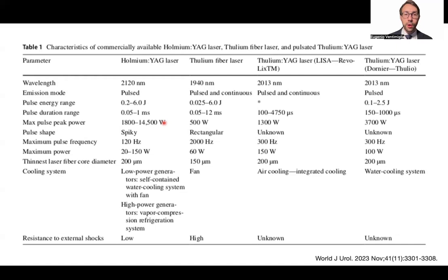And you know, if you like HoLEP very much, and if you follow this channel, I'm pretty sure that you do, you see that in order to have this very dissective effect of the prostate, separating the adenoma from the capsule, you will need this type of dissection that you're going to have very well with holmium and a little bit less with other lasers. Another thing is that holmium is a very modulable laser.